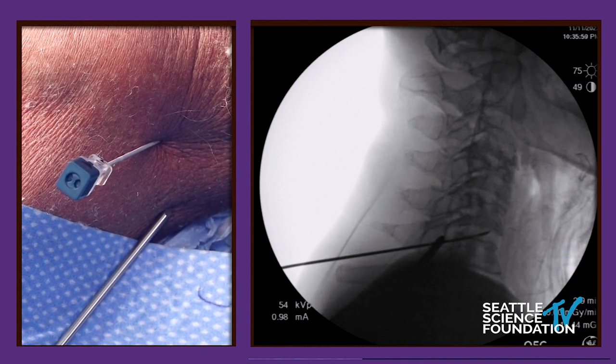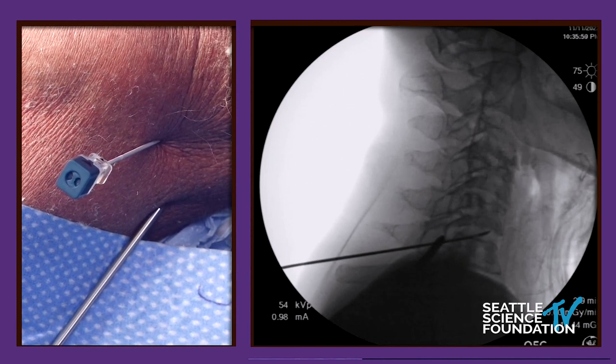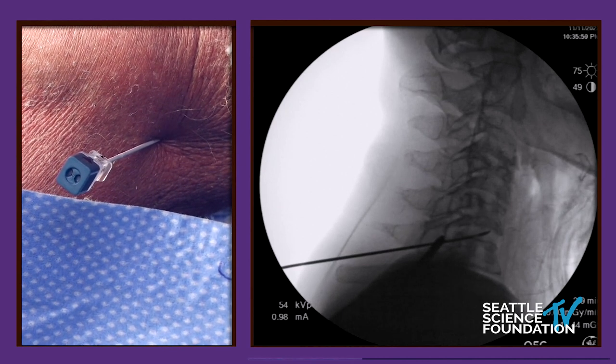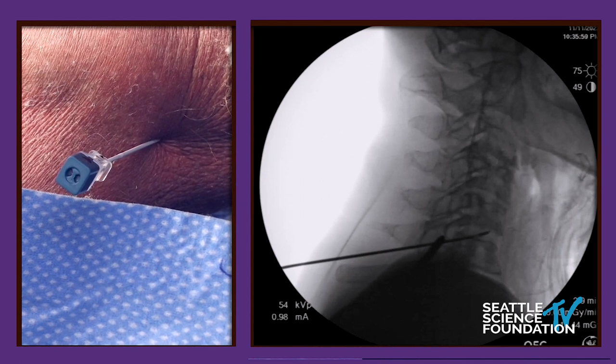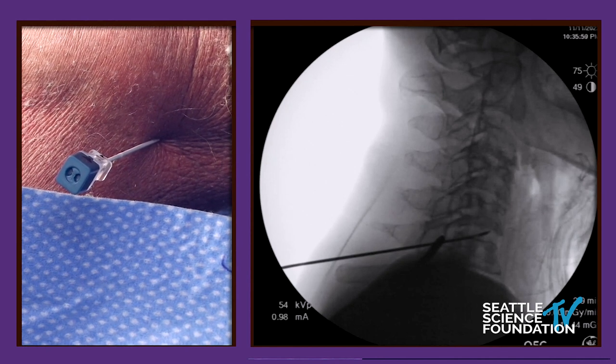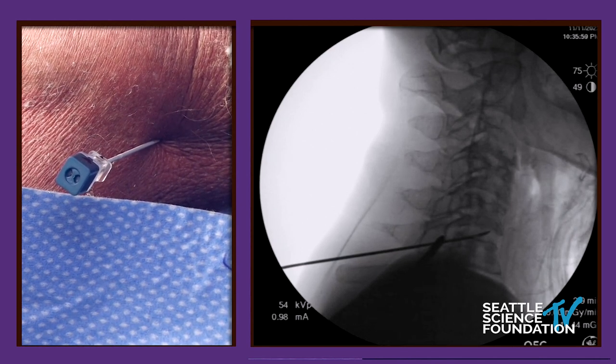This is a nice demonstration of how, once you move to a lateral position, the next goal in order to get a safe view is to get these two lamina to overlap with one another, so that you are approaching a true lateral view. So what I'm going to ask my x-ray technologist to do, it's 50-50 here, is to tilt in this direction or this direction, just a small degree. And if you could even do it in live, that would be ideal. Not this wigwag. This way is what I'm looking for.